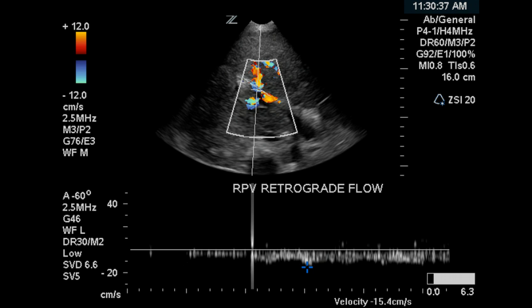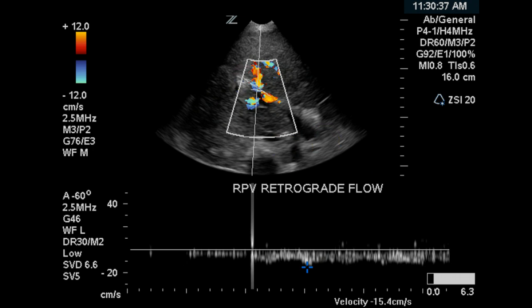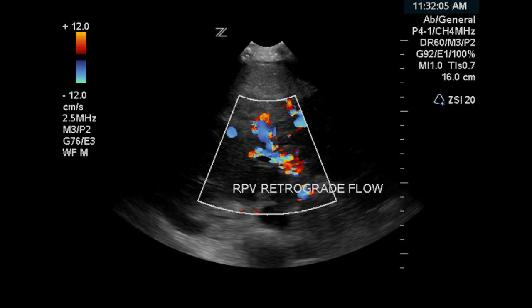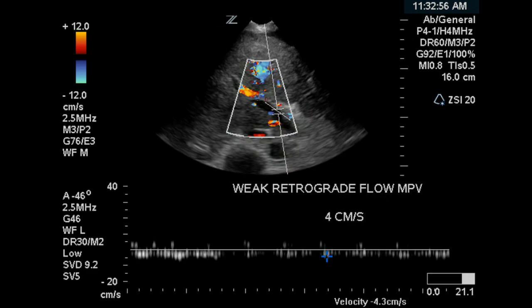A portion of the right portal vein has hepatofugal flow. We can demonstrate it's blue and it's flowing toward the porta and not away from the porta. Another demonstration of reversed flow in the right portal vein.